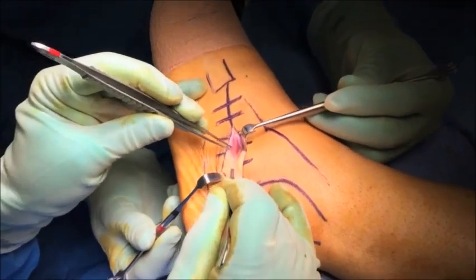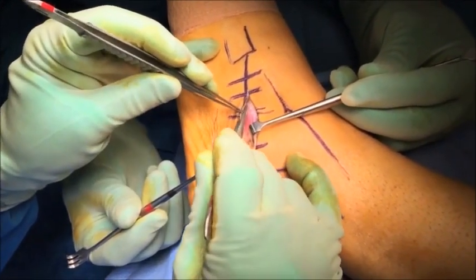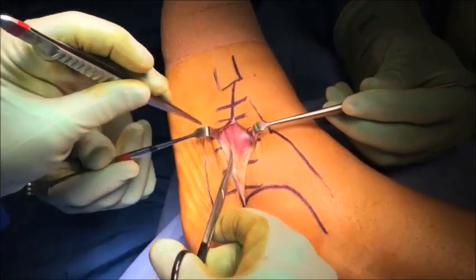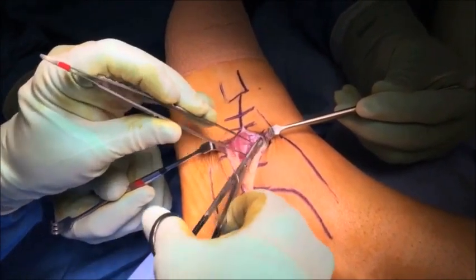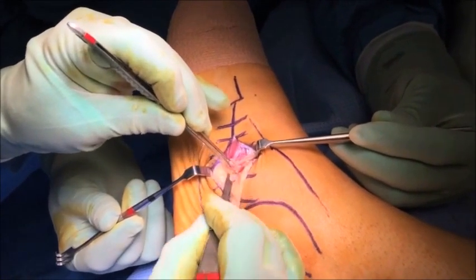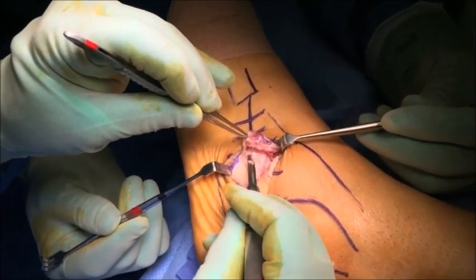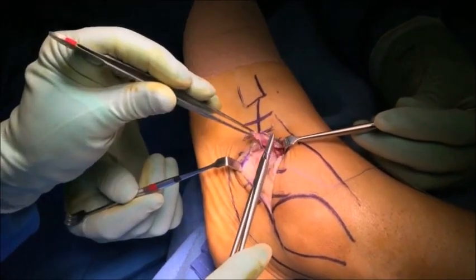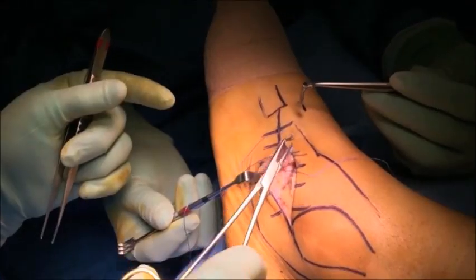Once the extensor digitorum brevis muscle is identified, it needs to be carefully dissected out. In the younger patient this muscle is quite well developed and defined and definitely worth dissecting out. In the elderly patient this muscle is often atrophied and it's easy to simply split the muscle belly in half to gain access to the subtalar joint. In this case we have a well-developed muscle belly which we are carefully dissecting out to identify the edges and origin of the extensor digitorum brevis. The muscle is released from its origin and dissected off the calcaneus all the way to the calcaneal cuboid joint. The muscle belly is then reflected distally and sutured to the distal skin so as to take it out of the surgical field and improve visualization of the subtalar joint.